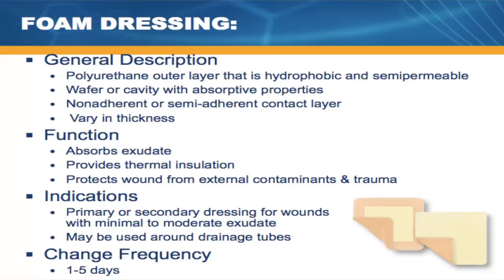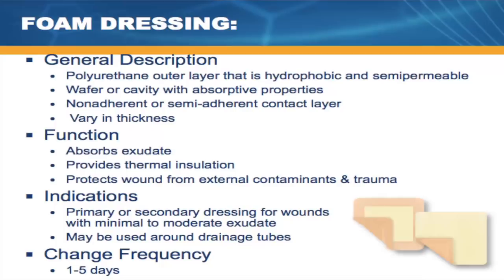So a foam typically made out of a polyurethane foam layer. Some of the foams have additional products to layer in beyond that polyurethane foam, but that is what's pretty consistent with polyurethane foams. There also are foams that have a silicone layer or a SafeTac layer against the surface, in order to prevent anything sticking from your polyurethane. They all look a little bit different. They're all different colors. These dressings also come in wide variety of shapes, sizes, different configurations.